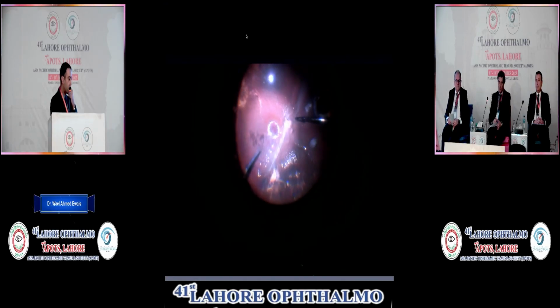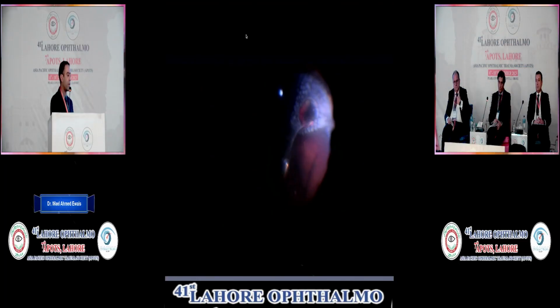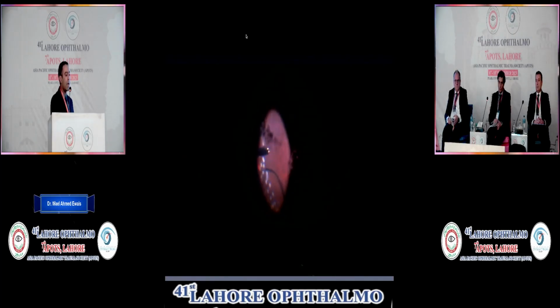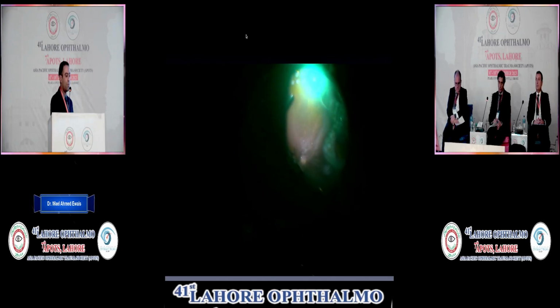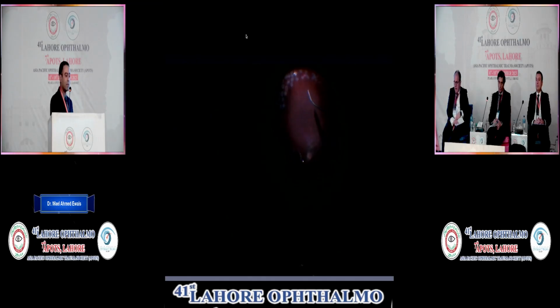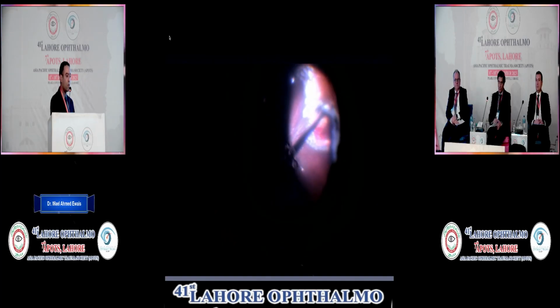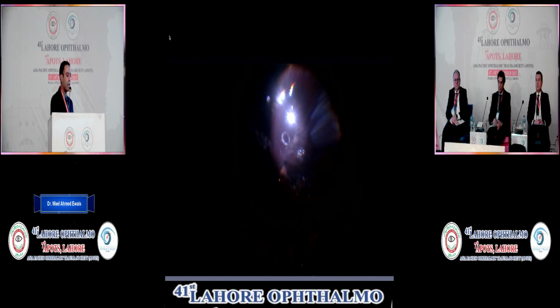I performed a PFC air exchange in the beginning, and of course laser at the area of the graft and the area of the retinectomies, and 360 laser prophylactic, as I usually do in trauma cases, and silicone oil tamponade at the end of the case.